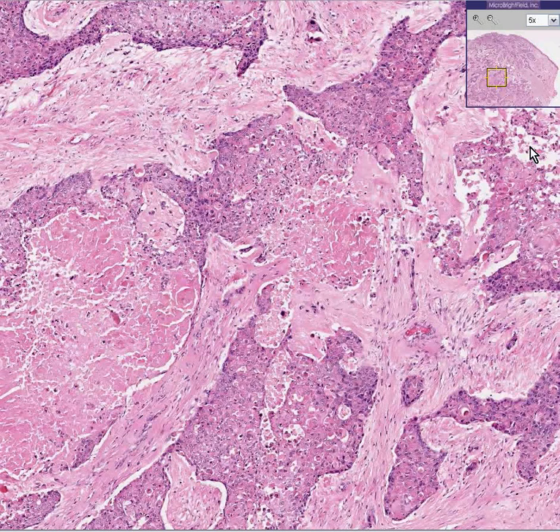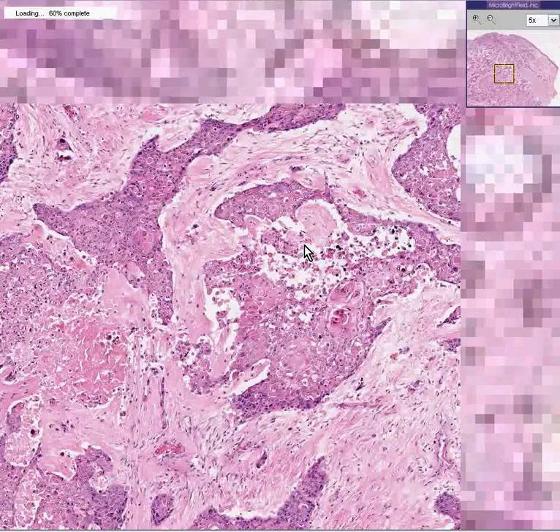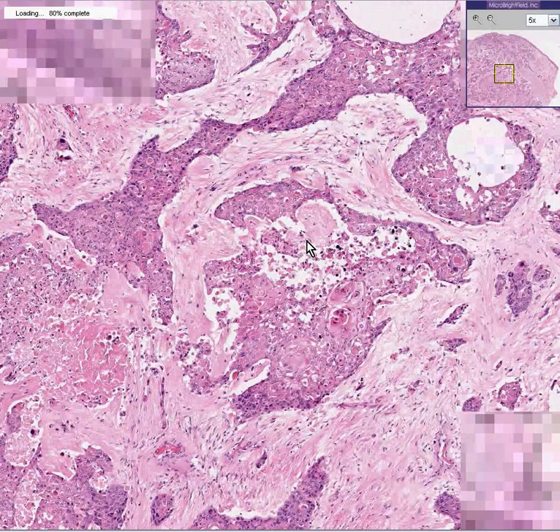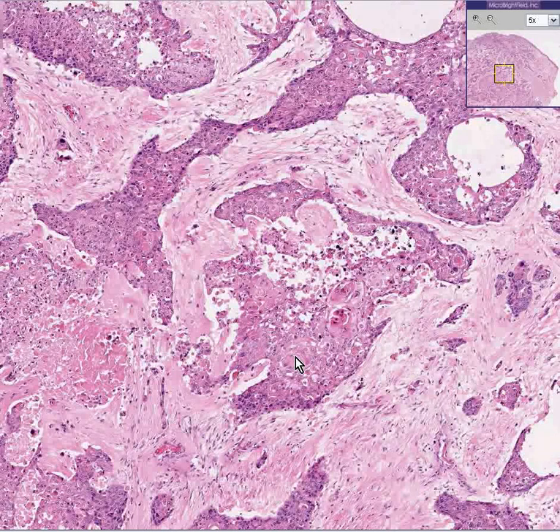In addition, we can see the classical squamous pearl, which is a whorl collection of tumor cells that looks like a little pearl.